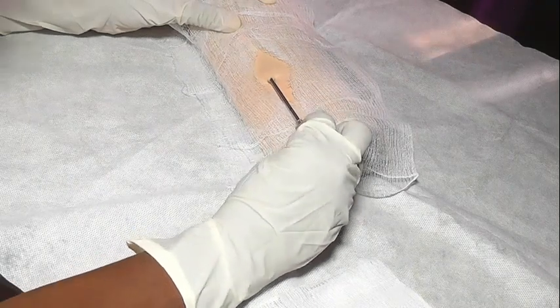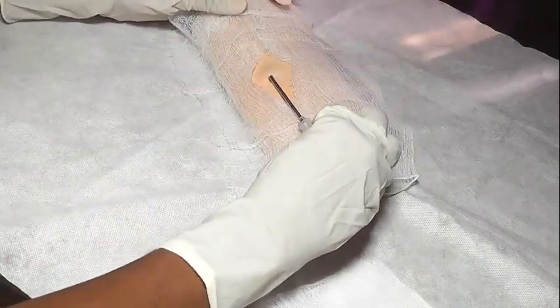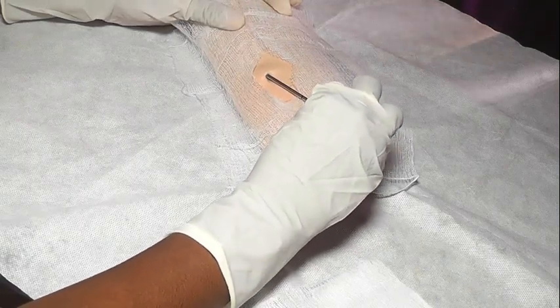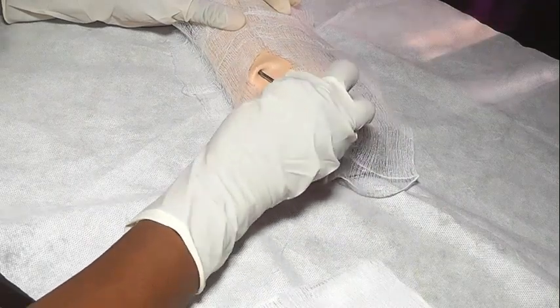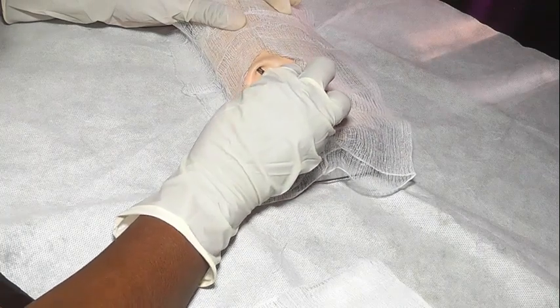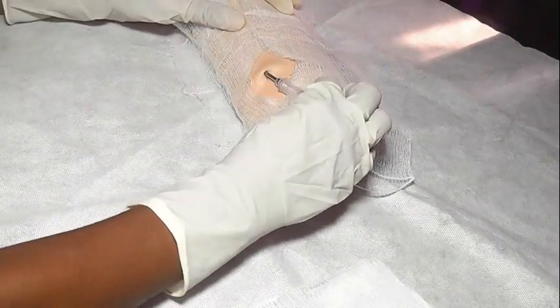Okay, I'll continue to withdraw. Alright, now I can see that mark, so I'm going to change direction. Okay, the V direction, and then I'll go the same way. Alright, I'll keep on tenting the trocar until the mark is reached. You can see that. Alright, so I'll do the same thing.